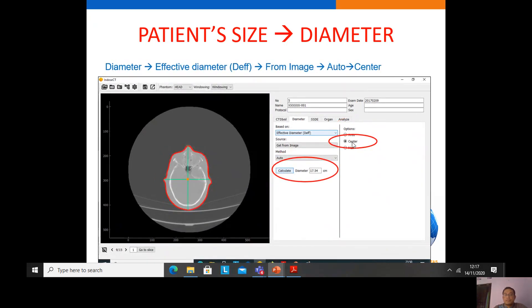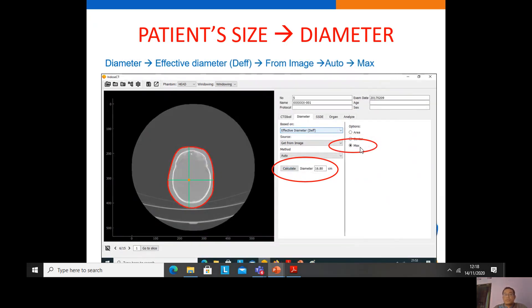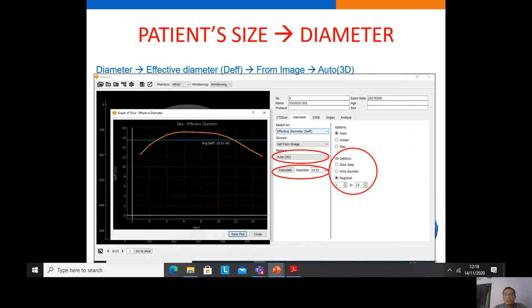If we choose maximum, the software automatically determines the maximum diameter position for AP and lateral and calculates the effective diameter. The software also provides auto 3D calculation for all images. We can calculate the effective diameter for every slice, with three options: slice step, slice number, and regional. For slice step of 1, the software calculates slice by slice; for slice step of 2, it calculates slices 1, 3, 5, etc.